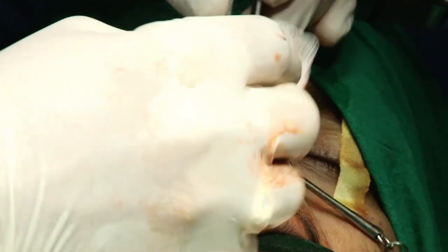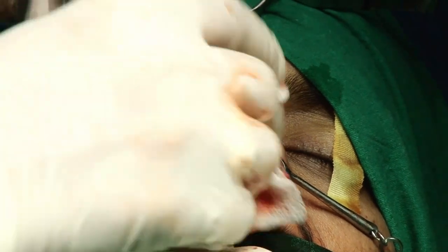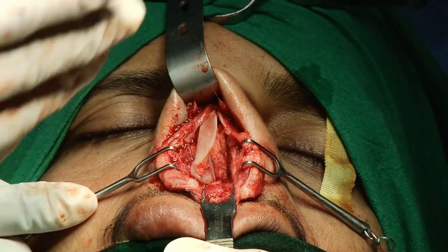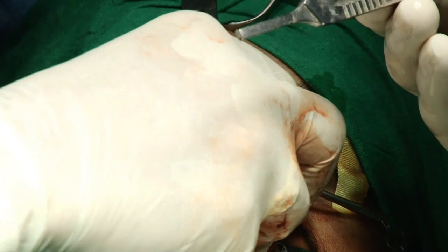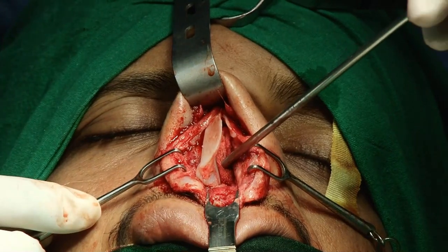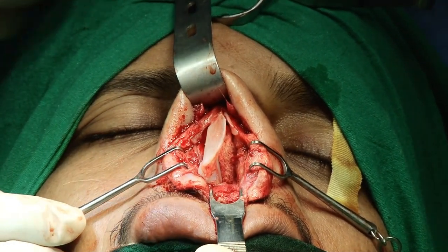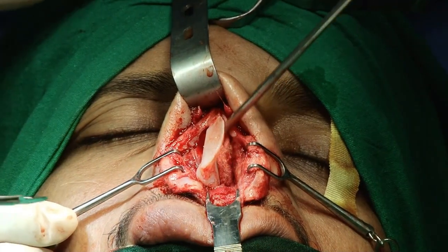But before you harvest or create your L-strut, first you analyze your septum. If we analyze this septum, look where we have this excess part. So first we excise that with a number 15 blade. Because if you look at the dynamics of this crooked nose, the crooked nose has one extrinsic force and another is the intrinsic force. Whenever we separate the upper lateral cartilage and the septum, you release the extrinsic force from the septum. On the other hand, the intrinsic force is like the deviated part of the septum.